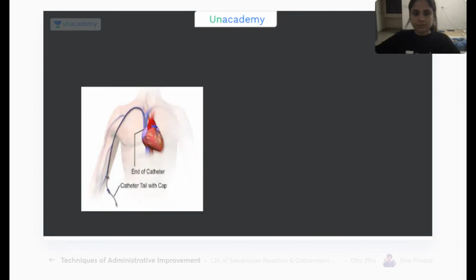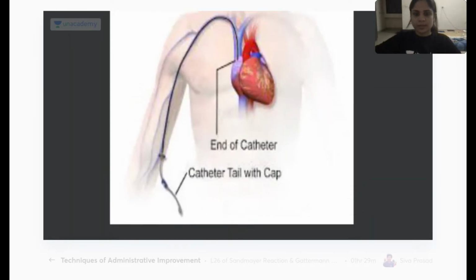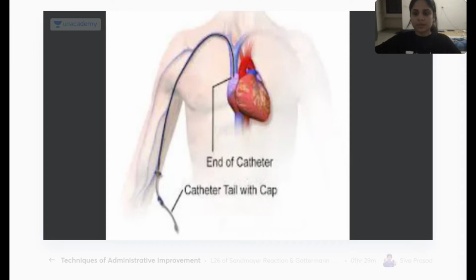All right. Now, identify this instrument that is going into the heart. See the position of the instrument and identify the instrument. Yes, very good, Phoenix. Now, can you tell me, is this coming from any of the central veins? It is going into the subclavian vein over here. Okay, and from here, what is the vein on this side? Cephalic or basilic? I have also forgotten which side is cephalic, which side is basilic. But I think basilic is correct.